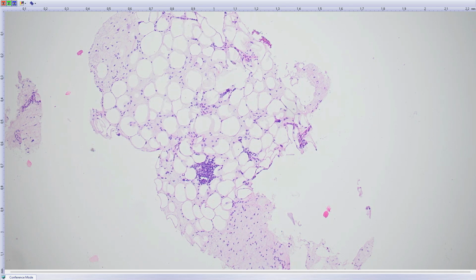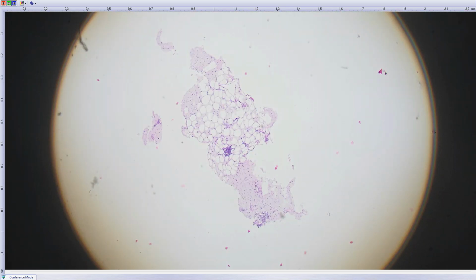Otherwise, getting back to the case Marián showed, the second one, the myxoid liposarcoma, both tumors are liposarcomas. This is well differentiated liposarcoma. The previous one was myxoid liposarcoma, and people tend to think that there is a group of tumors called liposarcomas with few morphologic subtypes, perhaps, but it's actually not right. The tumors are completely different.